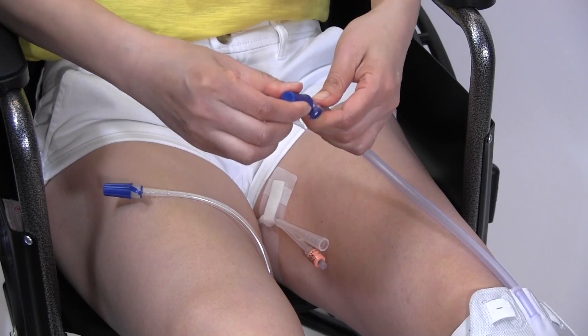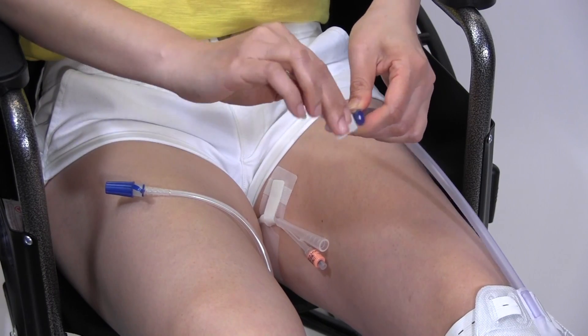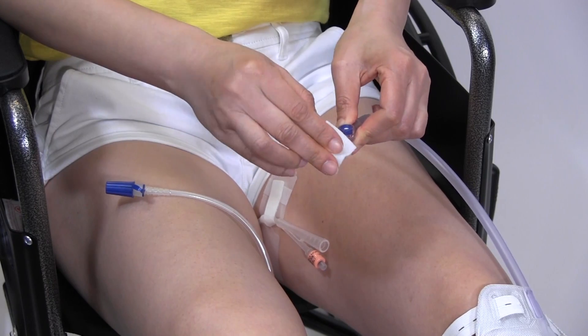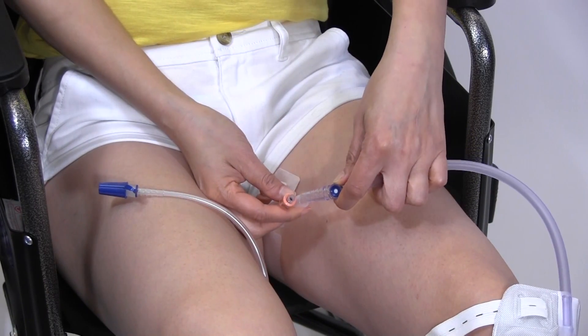Remove the cap from the connecting tube on the leg bag. Clean the connector with an alcohol wipe. Attach the connector to your catheter.